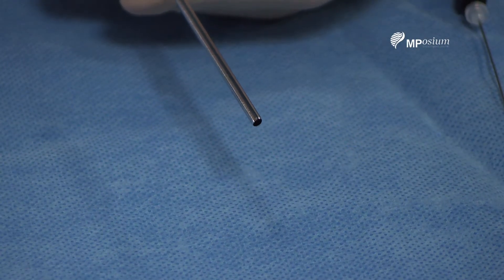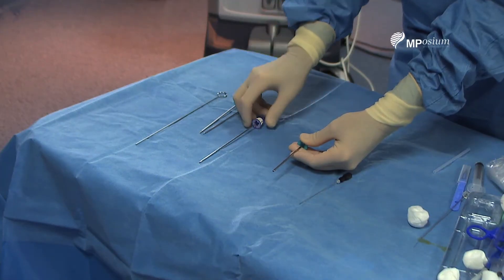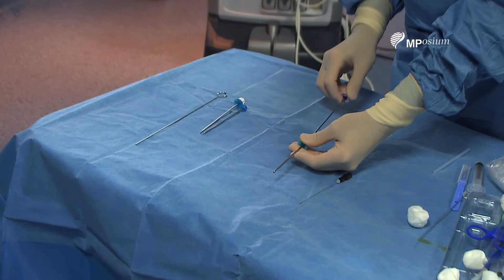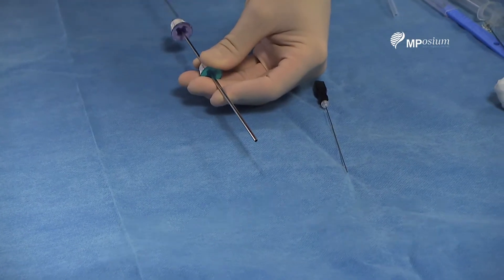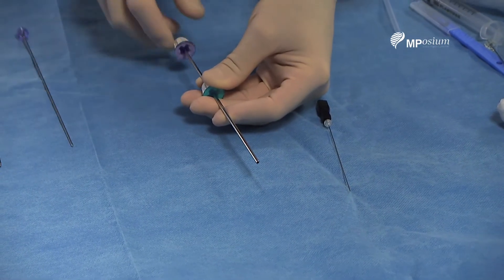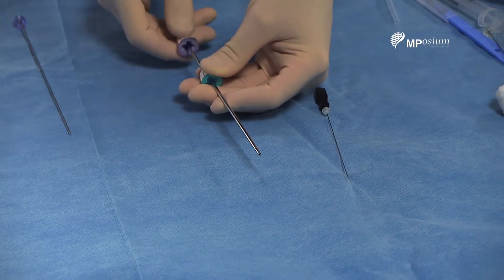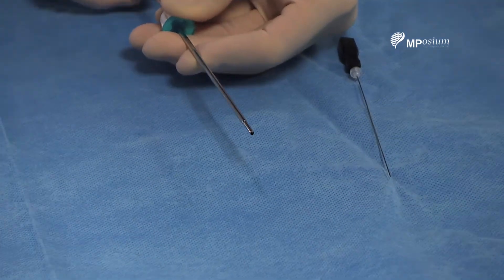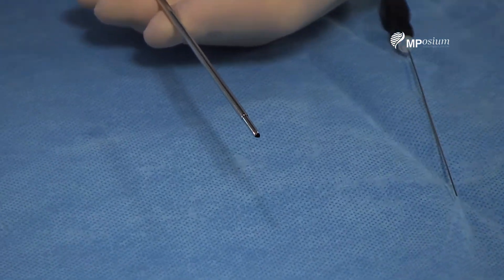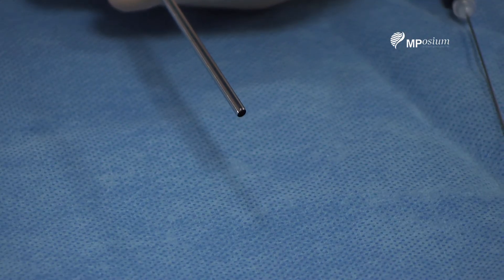When I am in place, I will insert through the cannula a needle that is ready for biopsy, and you can see I can go inside of the bone and get some sample using this needle.